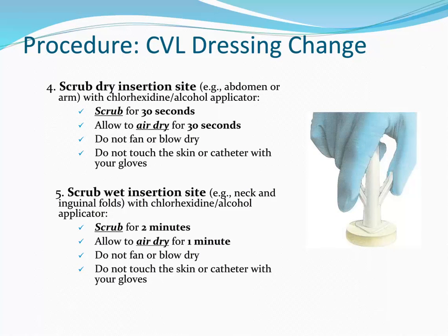Then scrub the insertion site with chlorhexidine. For dry insertion sites, scrub for 30 seconds and allow to air dry for 30 seconds. For wet insertion sites, scrub for 2 minutes and allow to air dry for 1 minute. Never fan or blow dry, and do not touch the skin or catheter with your gloves.